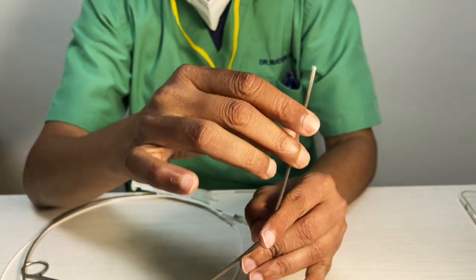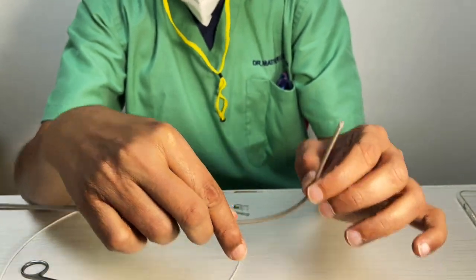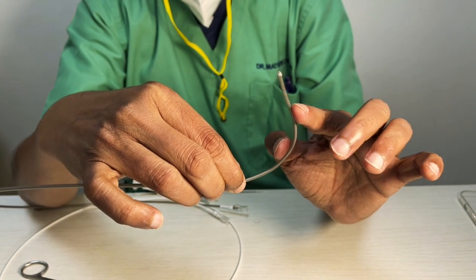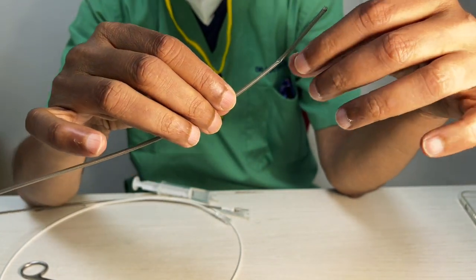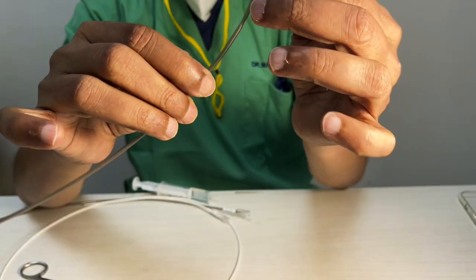Now remember one thing, if you have taken a long sheath like this, which is 90 centimeter, the soft segment gets longer. So if the soft segment is going to be at the junction between the arch and the common carotid artery, you'll have a problem. Suppose it is like this, what's going to happen? It will easily buckle out. You get this point? It's going to buckle out. It will be a problem. You'll kink it. You'll destroy it.